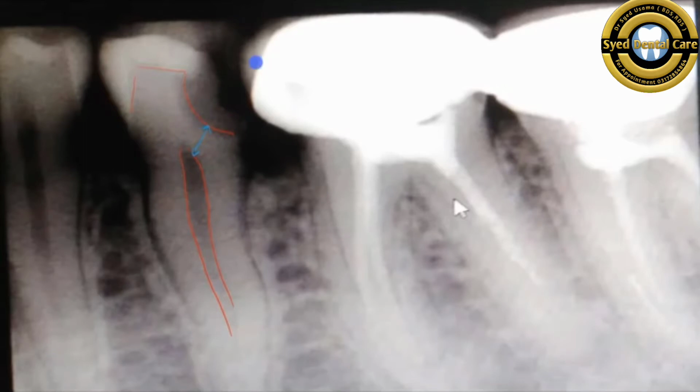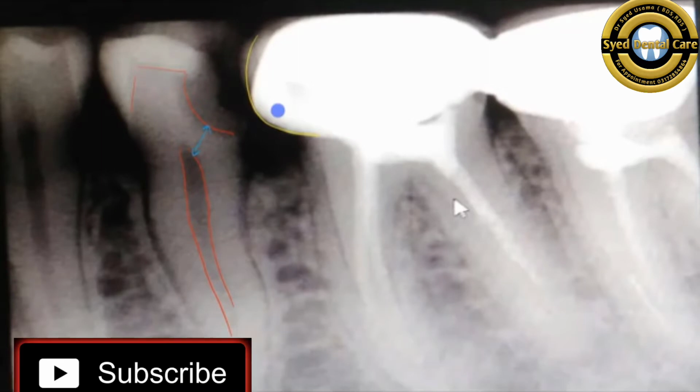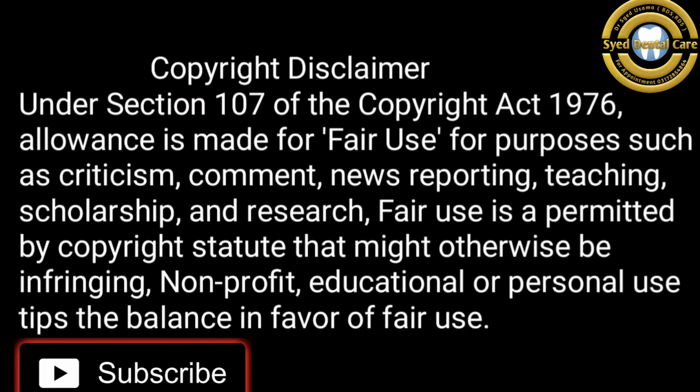Also in this radiograph you can see a crown which is placed on the adjacent tooth, and this crown has an overhang, meaning the proximal side of this crown has not been properly contoured, and probably this was the reason why food was accumulating here and led to the decay of the tooth in the first place. The patient was advised to replace the crown, but due to financial restriction the patient said he will replace the crown later. Therefore we started the treatment without changing the existing crown. It's less than the ideal scenario, but we will work for now.